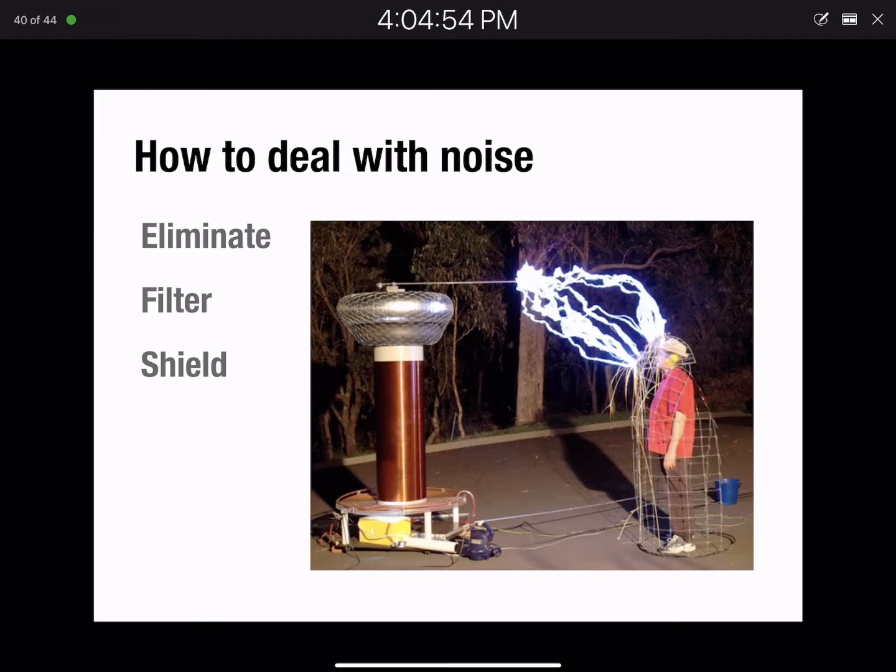But if you just run a power cord to your monitor inside the Faraday cage, you've basically defeated the purpose of the Faraday cage, because that wire as it's coming in is also a conductor. It basically acts as an antenna, so any other ambient electromagnetic noise in the environment is going to induce its current in that wire. That's going to be brought into the booth, and it doesn't really matter if you've got a fancy, expensive Faraday cage around the booth. You've basically circumvented that, and you've brought this artifact in.